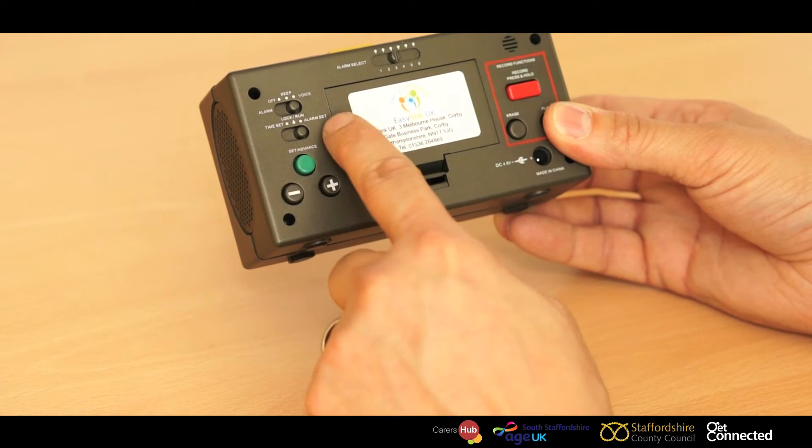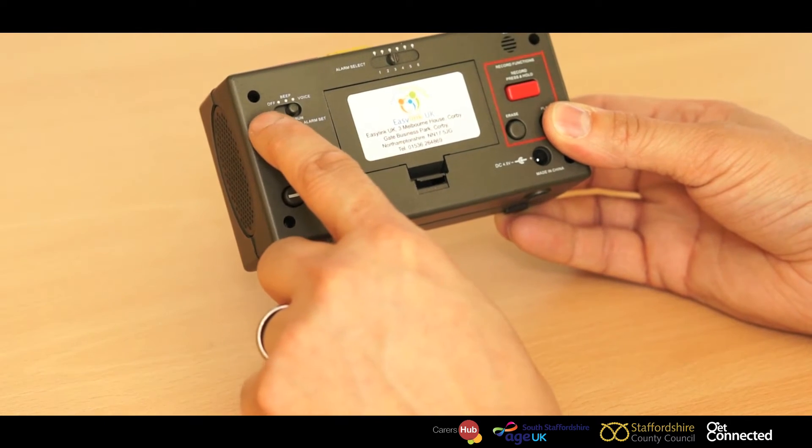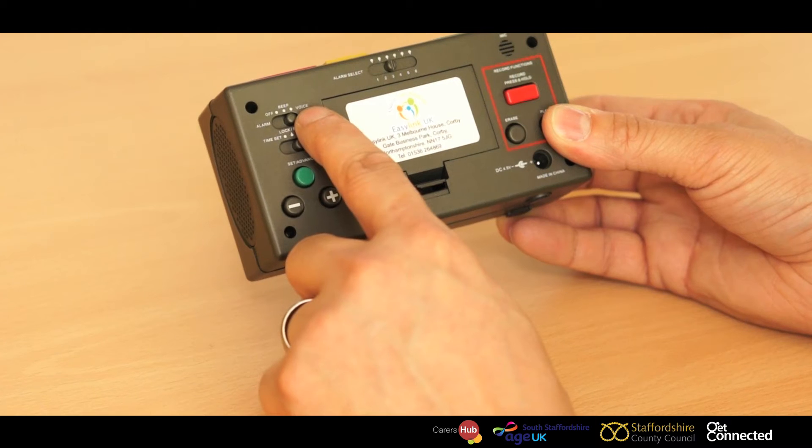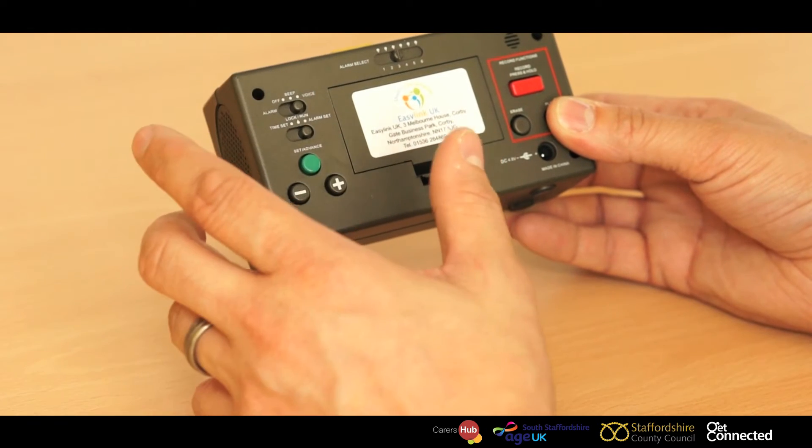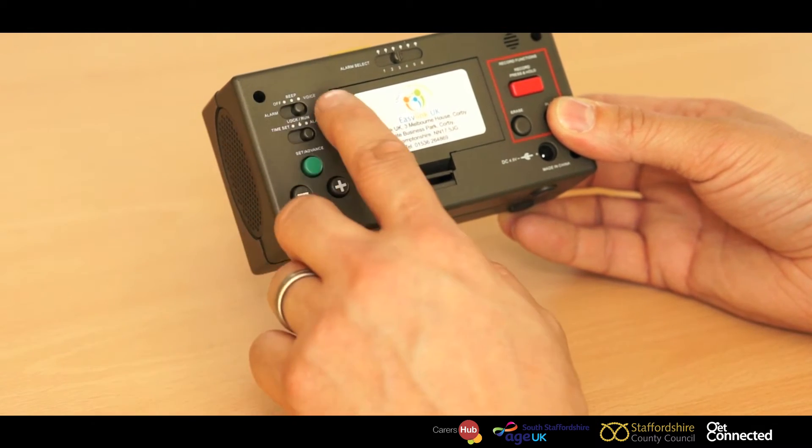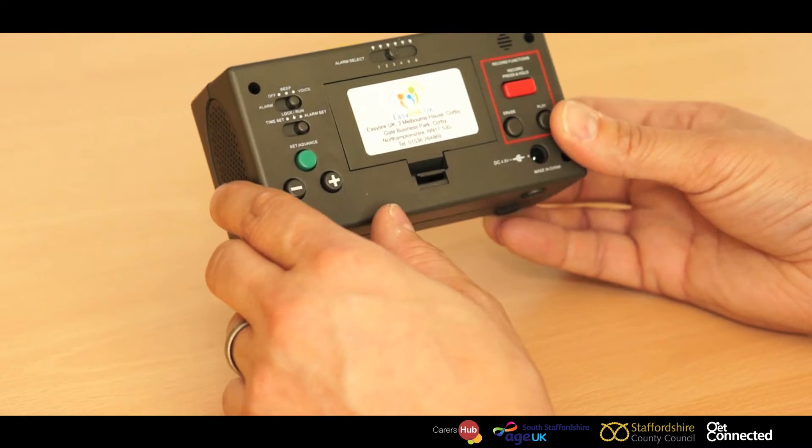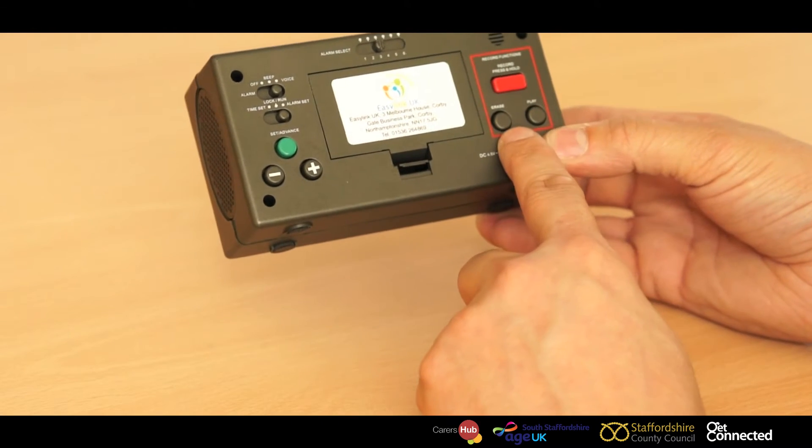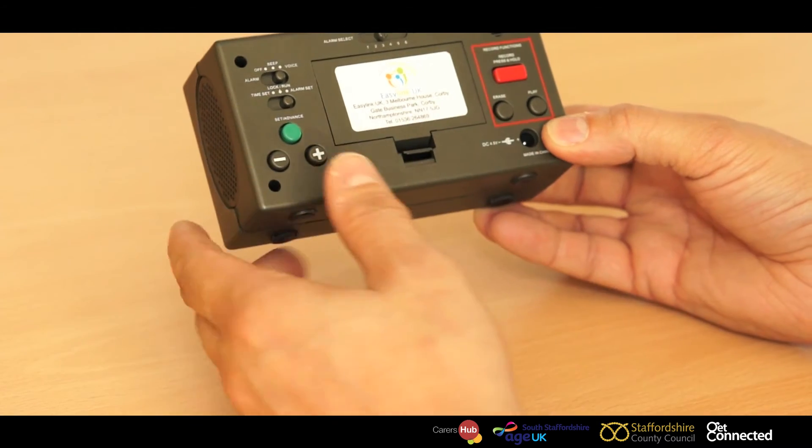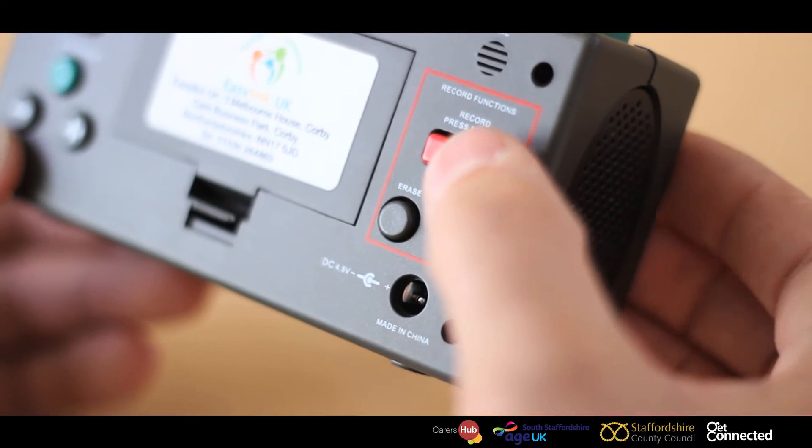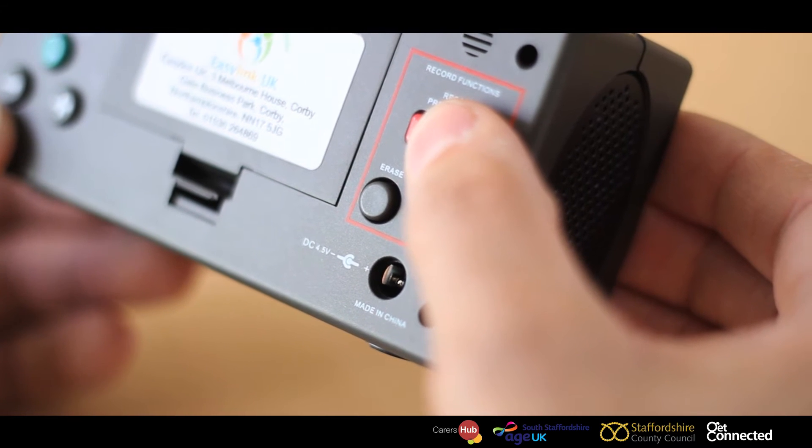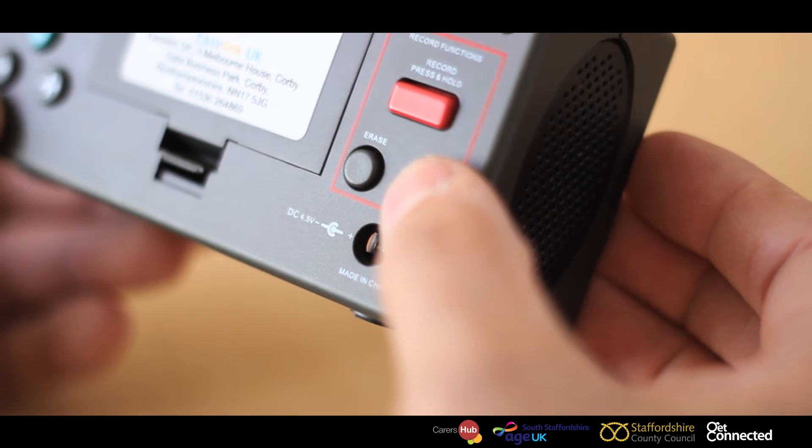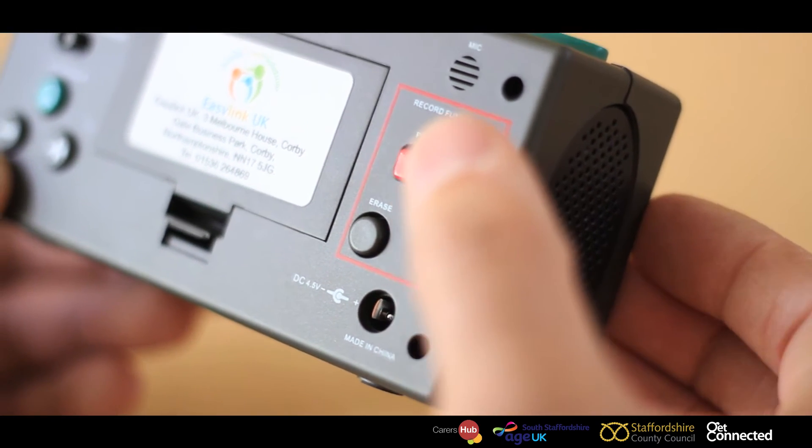Also just above alarm set, you'll notice there's alarm and voice. This will give you an option. Do you want a beeping sound as an alarm or an actual person's voice prompt, which you can record here on the right hand side? What you do is you push and hold the red button and speak clearly into the microphone of the prompt that you would like to get across.